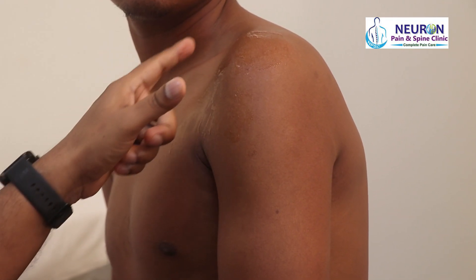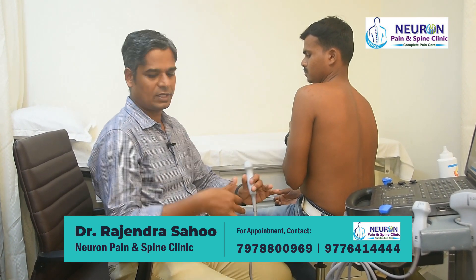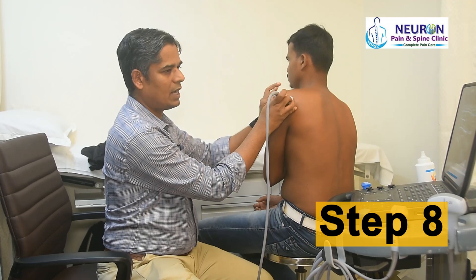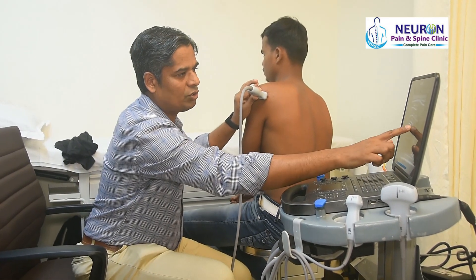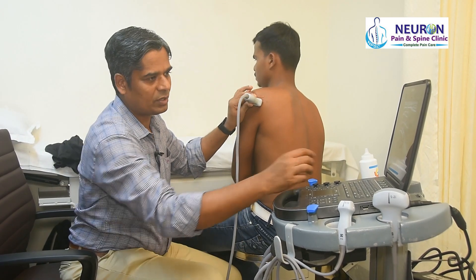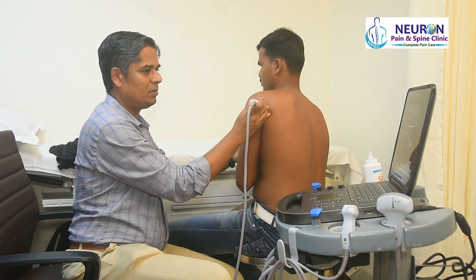Now that I've completed the anterior and superior parts, I'll turn the patient to the side to look at the posterior glenohumeral joint. For the posterior glenohumeral joint, the patient's hand is approximated to the opposite shoulder so the joint is exposed. I feel for the scapular spine, place the probe just below it, and look into the joint. What you see here: this is the humeral head, the deltoid muscle, and the infraspinatus. A dynamic assessment — I tell the patient to do external rotation.